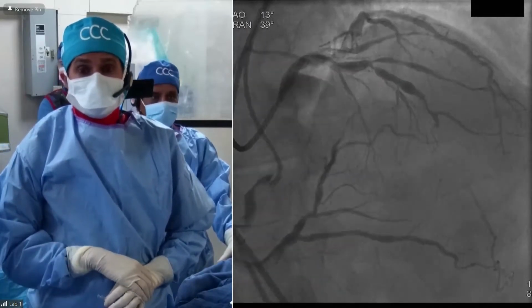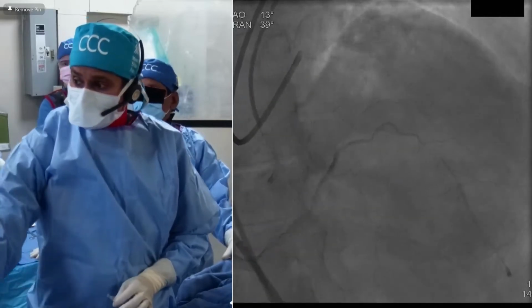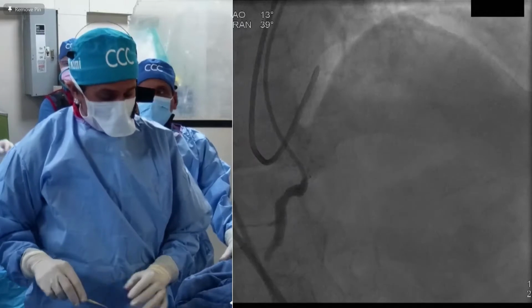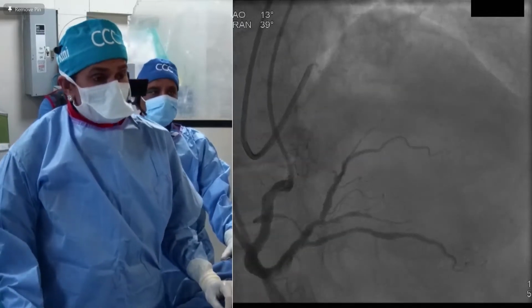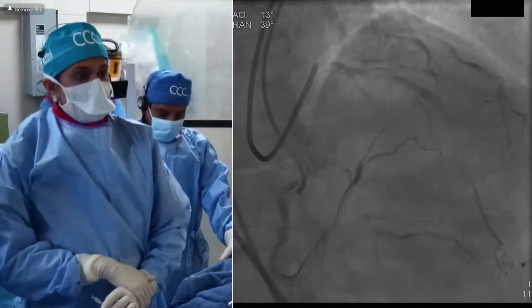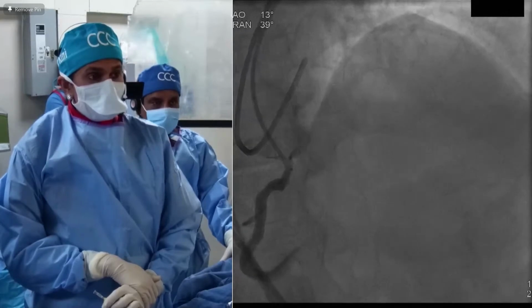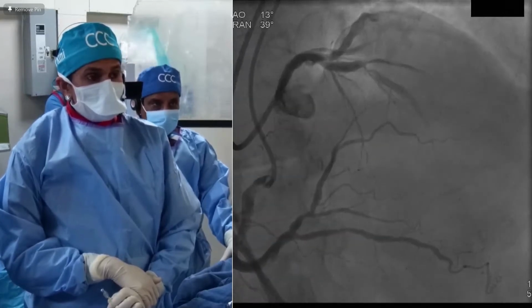Those are going to be pretty far apart. Remember, we're looking at a 4-centimeter keyhole incision, so you'd either have to make a bigger than usual mini thoracotomy to graft these two, or treat this as a hybrid approach: graft the distal LAD with the IMA, and then stent the proximal LAD into that diagonal.